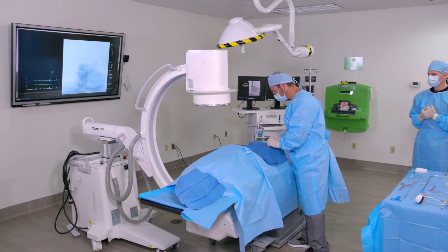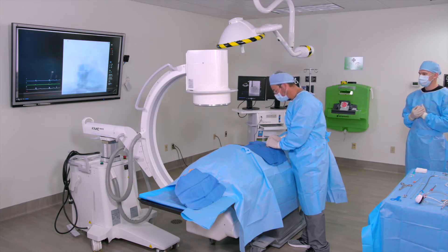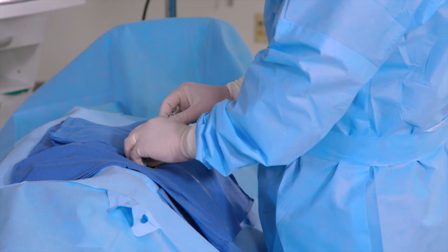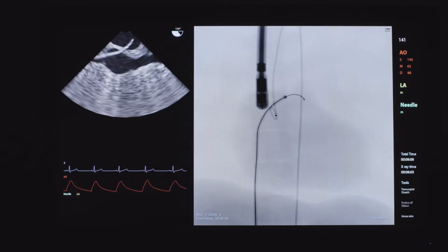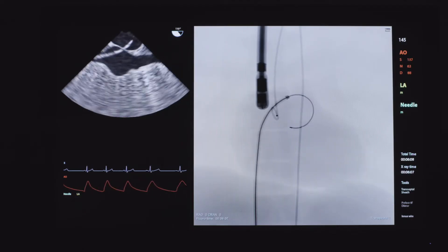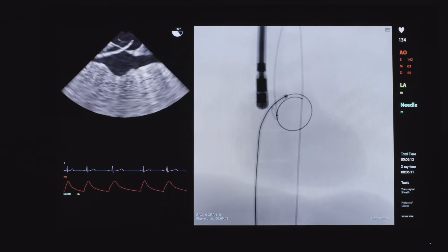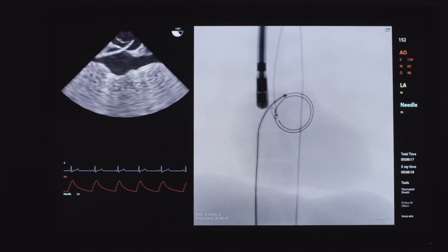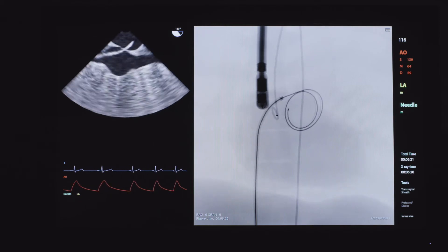When utilizing the Tandem Heart Procedure Kit, begin the insertion process of the transeptal and arterial cannula. Use a standard transeptal puncture technique to gain access into the left atrium from the femoral vein. Remove the transeptal needle and introduce a guide wire into the left atrium. Remove the transeptal catheter and sheath.